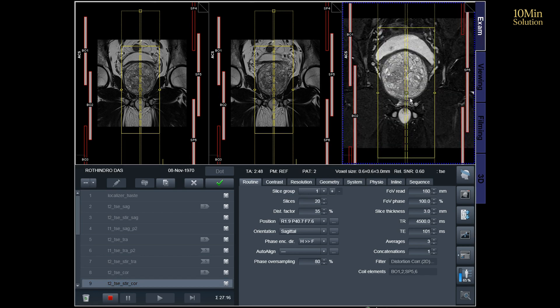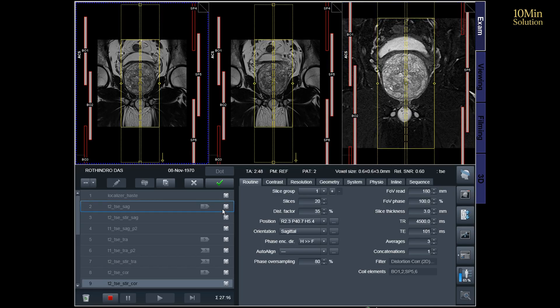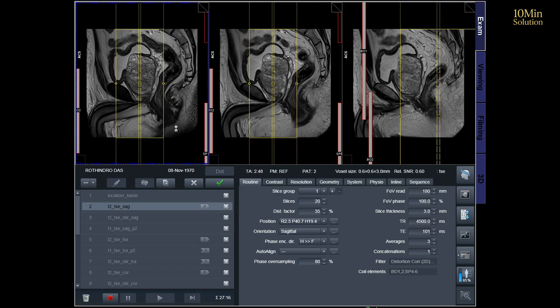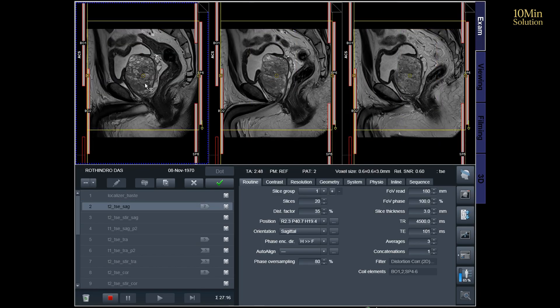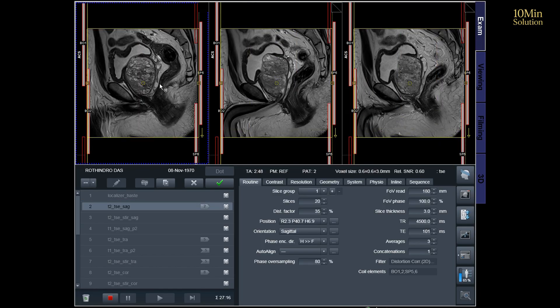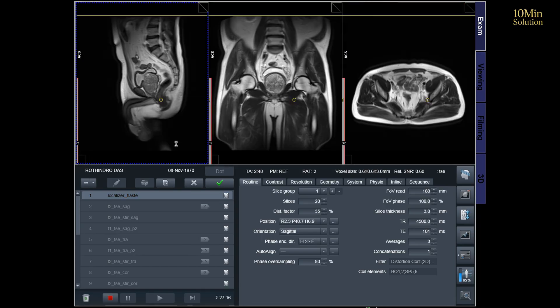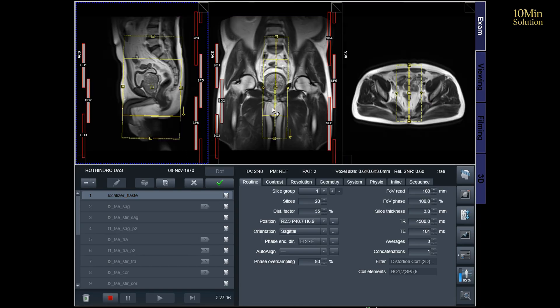Additionally, to minimize artifacts arising from arterial pulsation, peristalsis, and breathing, consider incorporating saturation bands on the top and front of the sagittal block.